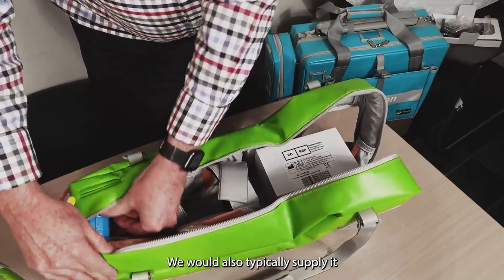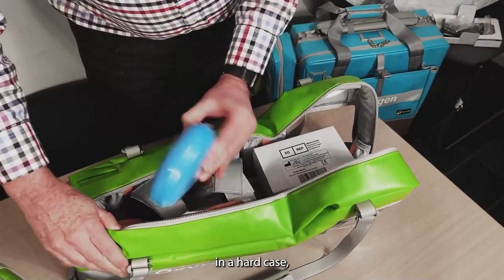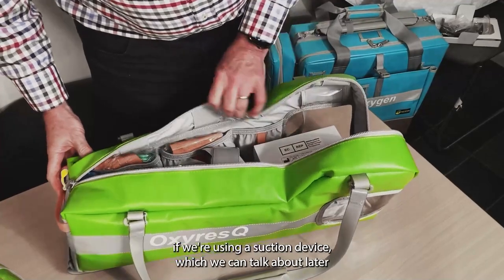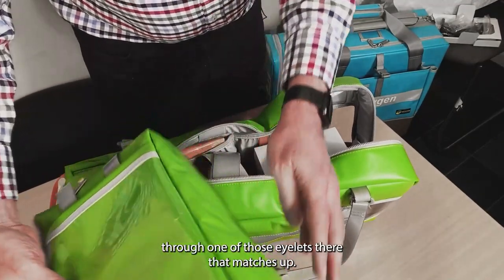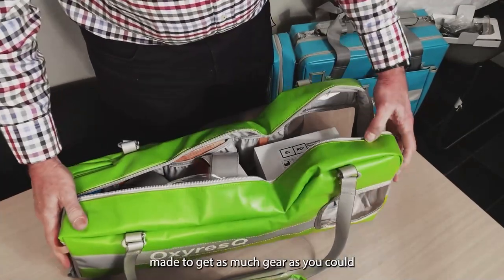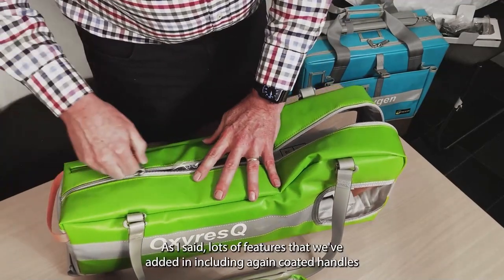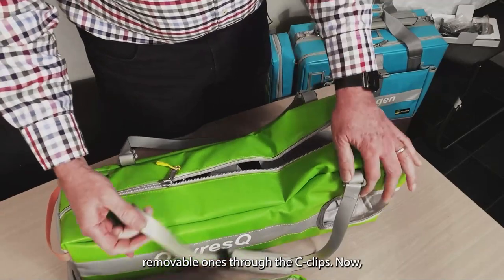We'd typically also supply extra oxygen tubing and a CPR mask in a hard case. The oxygen hose can, if using a suction device, come through one of those eyelets into the top pouch. It's a really neat compact size bag made to get as much gear as you'd want to carry into a fairly compact format — reasonably priced, with lots of features including coated handles and removable C-clip handles.